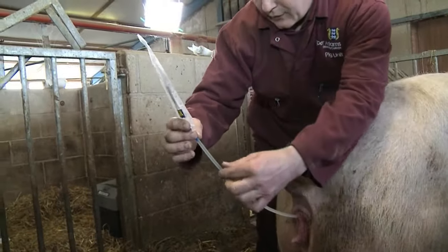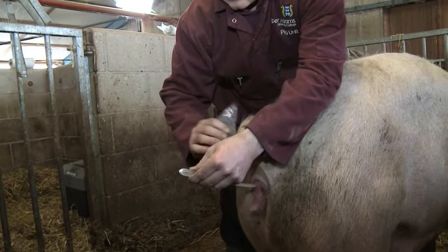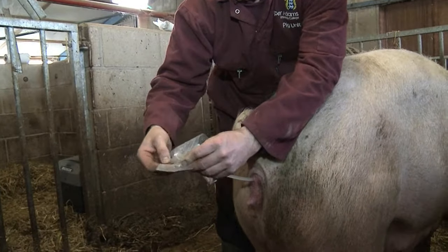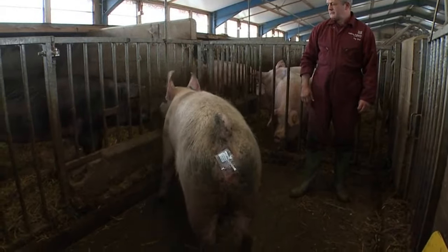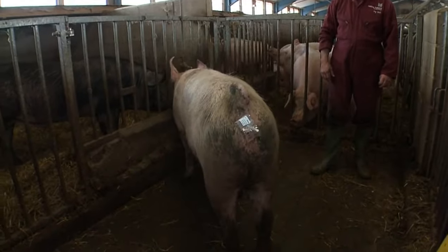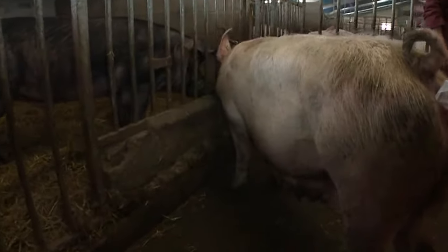The catheter is left in place for a couple of minutes so that it's easier to remove once the cervix has relaxed and so reduces the likelihood of back leakage. Leave her to rest for ideally a period of 30 minutes before she's returned to her pen and re-mixed in with the group.